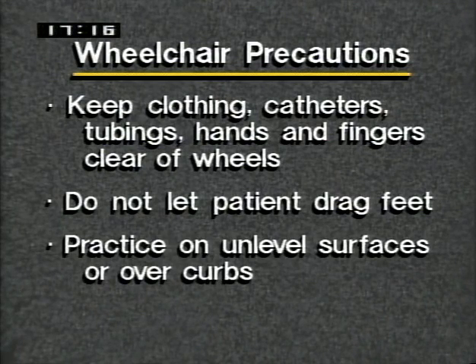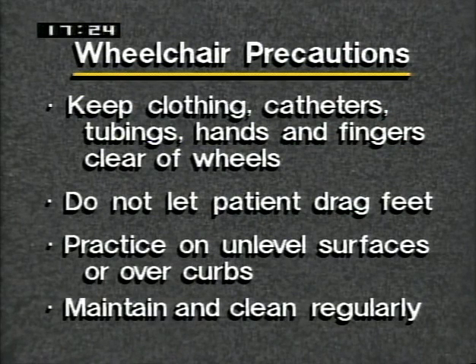Practice wheeling the wheelchair on unlevel surfaces or over curbs before you work with the patient in a similar situation. Be sure that the wheelchair receives regular maintenance and cleaning. This will ensure that all parts are working correctly and safely, and that there are no unpleasant odors.